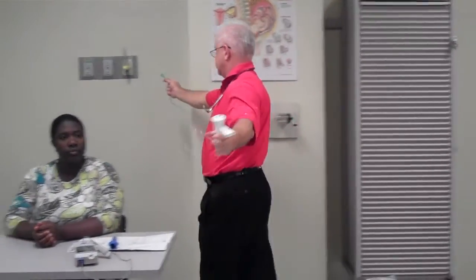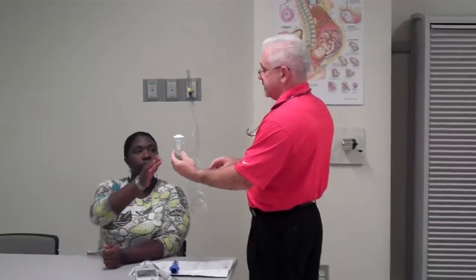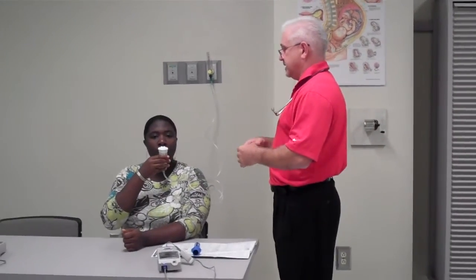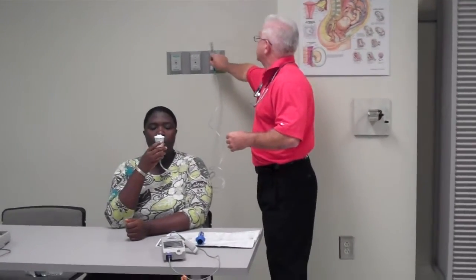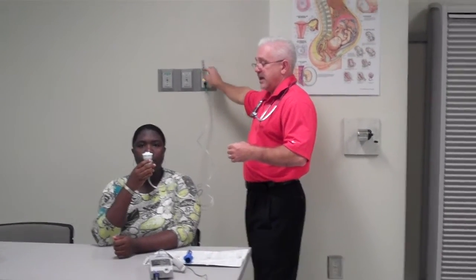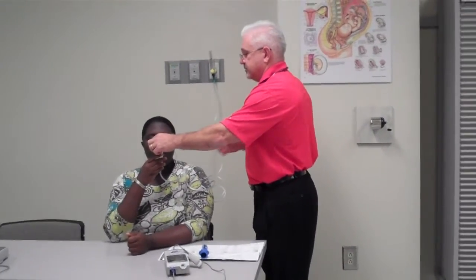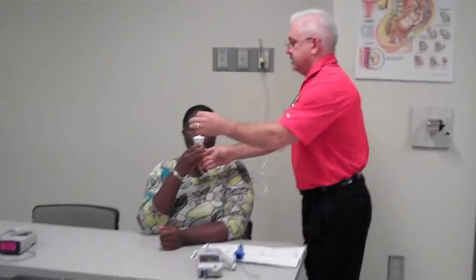I hook it up to the flow meter, and at this point, I would tell the patient, I need you to put this in your mouth, and what I want you to do is breathe in and out slowly. And I will turn the flow on, and take a deep breath in. I'm going to turn this now to just adjust this. And we'll see the continuous mist. Can you see that with the video camera? Come a little closer, please. I want you to see the mist that's being created.